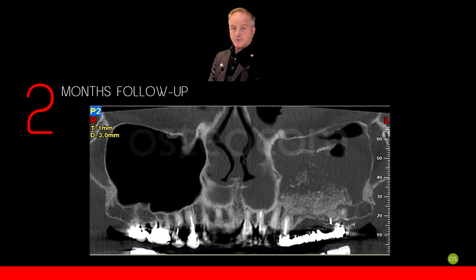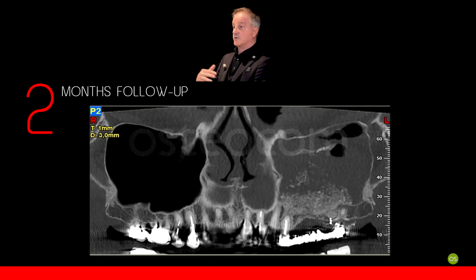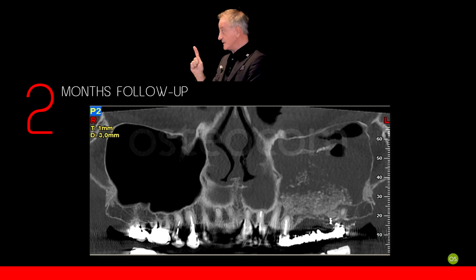at 2 months you have this problem, 99% of the doctors will say sinusitis. I know this paper has been around 3 years. Why? Because all the referees asked for more explanation. Why? Because they said, sinusitis, the less knowledgeable, no, you have a sinusitis here. Big mistake, because the patient is not a CBCT. This is a sinus opacification, full stop, not a sinusitis.